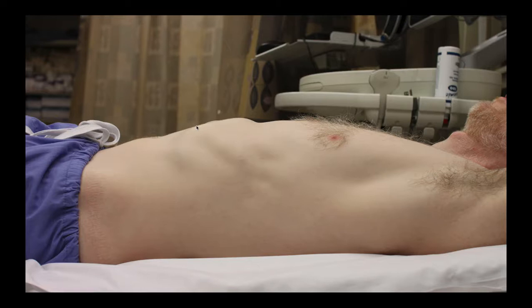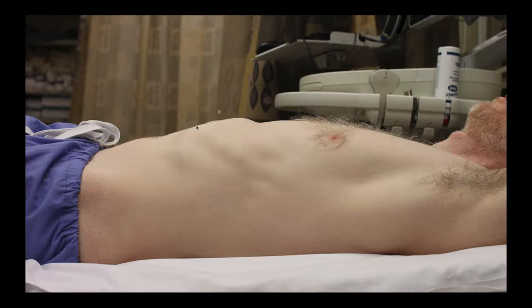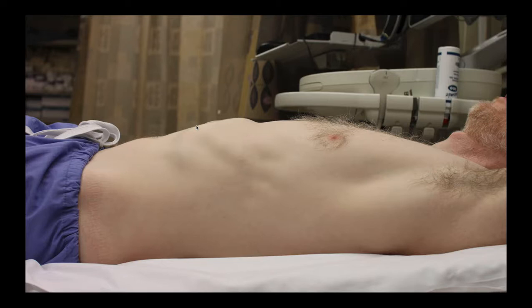Some people actually talk about placing the patient in the left lateral decubitus to look right above the liver. I find that that is a little cumbersome sometimes, so I just have them lay on their backs however they are when I see them and scan just the most anterior part of their abdominal cavity.